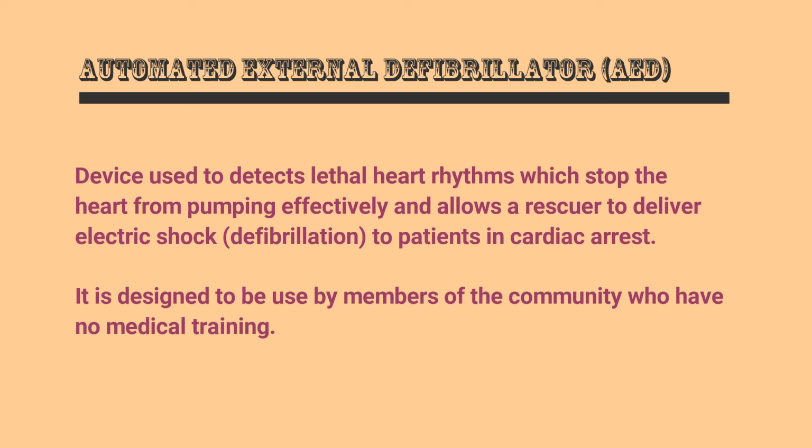An Automated External Defibrillator, or AED, is a device used to detect lethal heart rhythms, which stop the heart from pumping effectively. It allows a rescuer to deliver an electric shock, or defibrillation, to patients in cardiac arrest. An AED is designed to be used by members of the community who have no medical training.